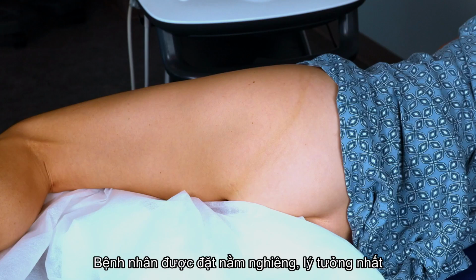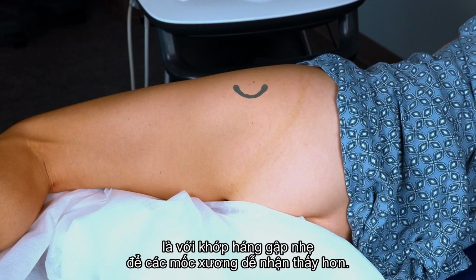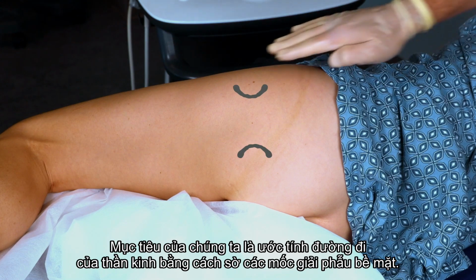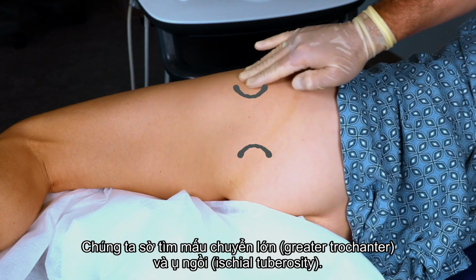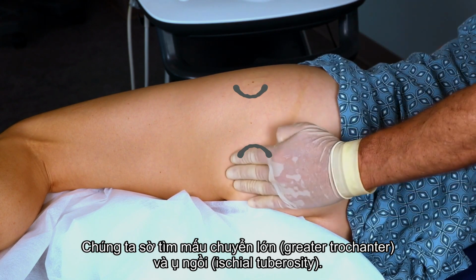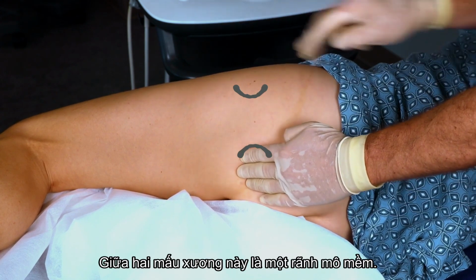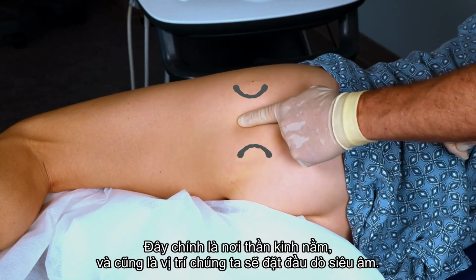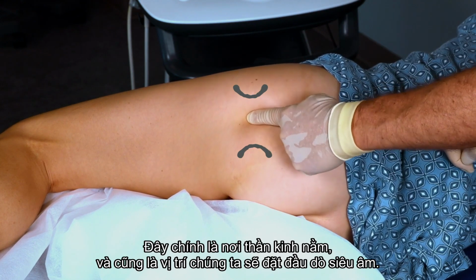The patient is positioned on their side, ideally with the hip flexed to make the bony anatomy more prominent. Our goal is to estimate where the nerve travels by palpating the surface landmarks. We feel for the greater trochanter and the ischial tuberosity. Between these two bony humps is a soft tissue trough. This is where the nerve lives and where we're going to place our ultrasound probe.